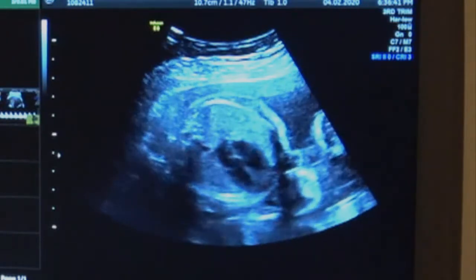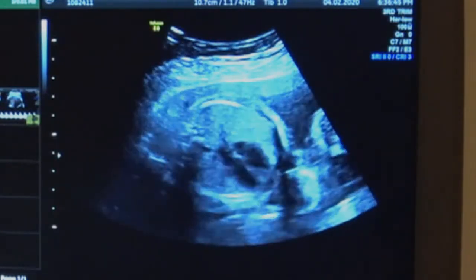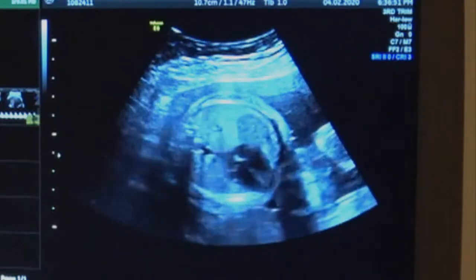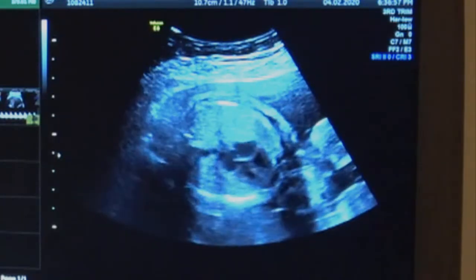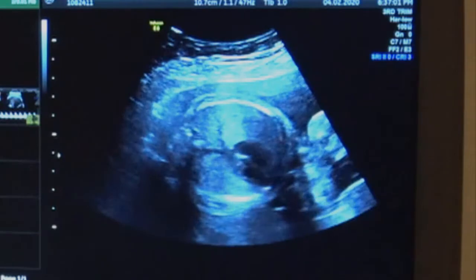We do the MCA PI, we do the umbilical artery PI, we do the CPR ratio. We very, very rarely do the ductus venosus. Although I was down at Gold Coast University helping Andrea, and they do it routinely. They're a tertiary centre there at the hospital, and they just do it on all of their babies.